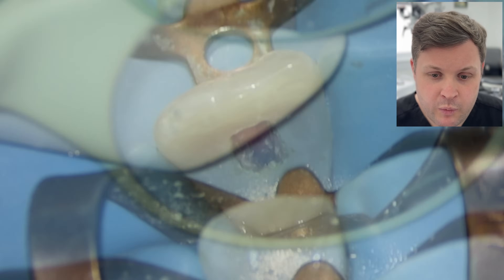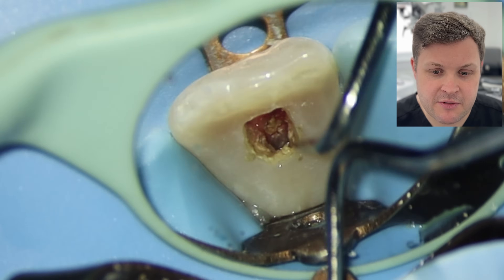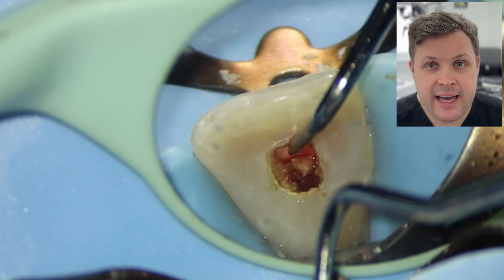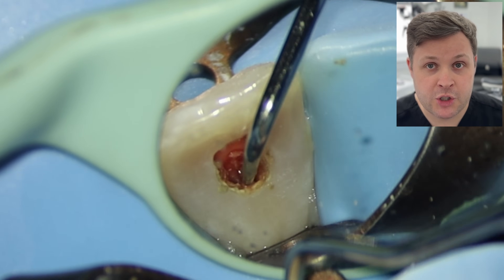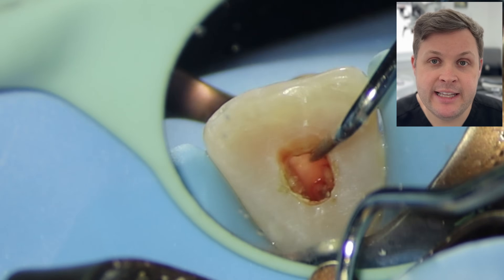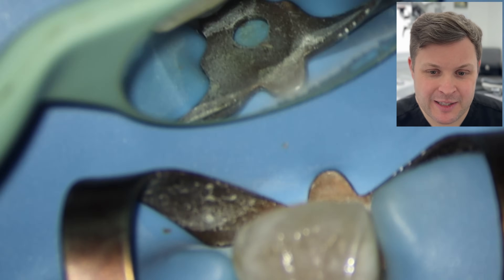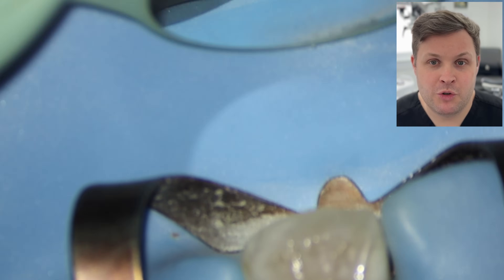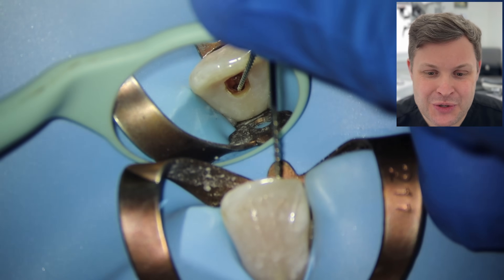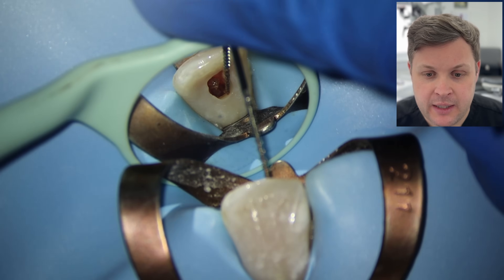Now that it's a little bit open, I'm going to try and dislodge the pulp because I want to try and remove this pulp in one piece. There's a real risk that if I get a rotary file down there and it churns up this pulp and collagen, it can create like a glue or a plug — once you've plugged up the root canal, it's really difficult to remove that type of pulp. I'm using an H file to try and hook it up. Ideally a barbed broach would be better in this case, but I don't have any barbed broaches in the practice, so I'm doing my best here.